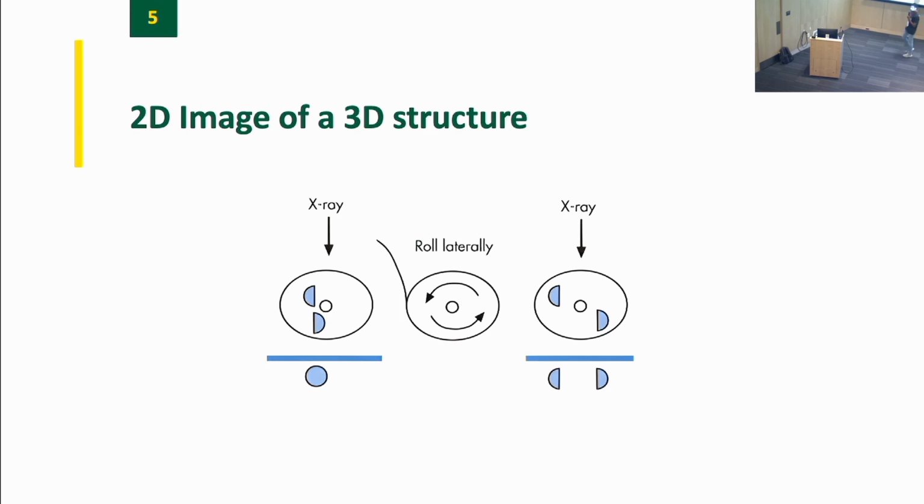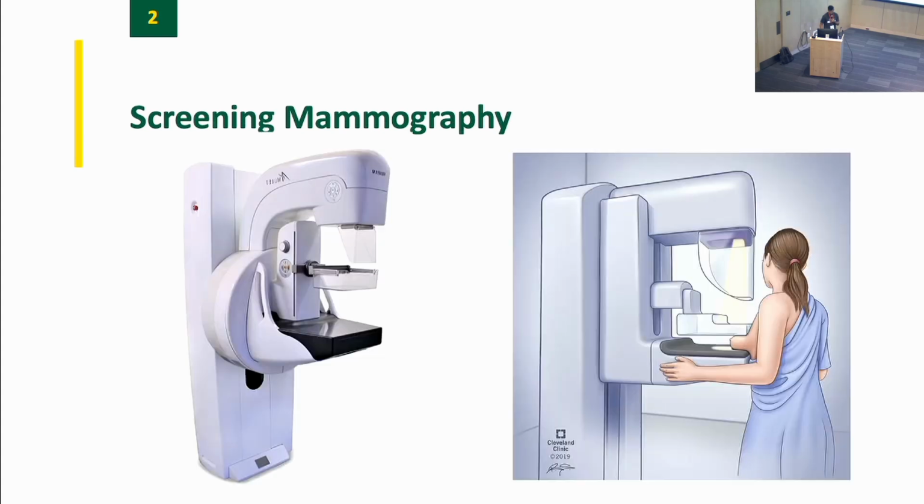This is at the heart of a lot of the breast imaging that we do: deciding whether or not the thing that you're looking at is actually an abnormality. Is it a circle, or is it just two semicircles, meaning two benign things projecting over each other? Okay. Does everyone understand that concept? Okay. Question? Oh, okay. All right, so going back.